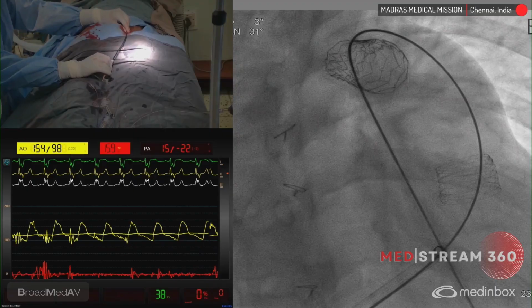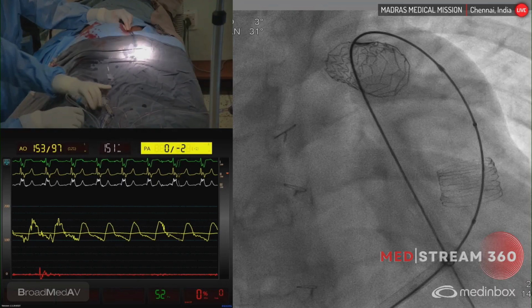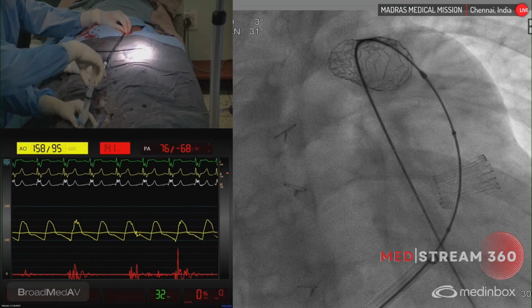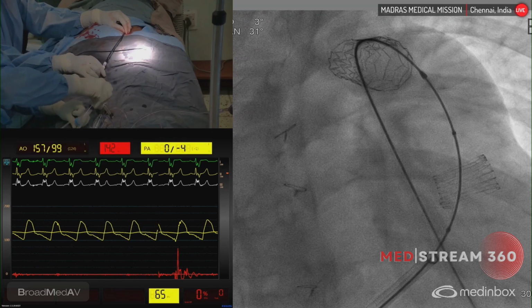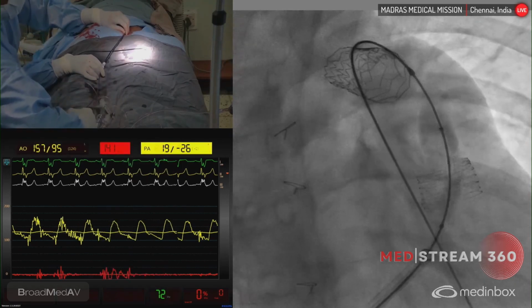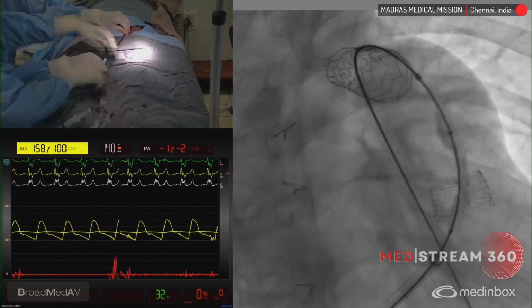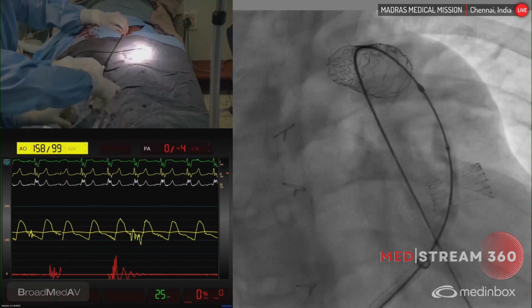Yes. So I'm taking this out and I'm now changing it into a 22. We have sufficient volume. The volume looks adequate. So, okay. Vishnu, you are positioning the, yeah. So, I will just get the balloon a little bit below.